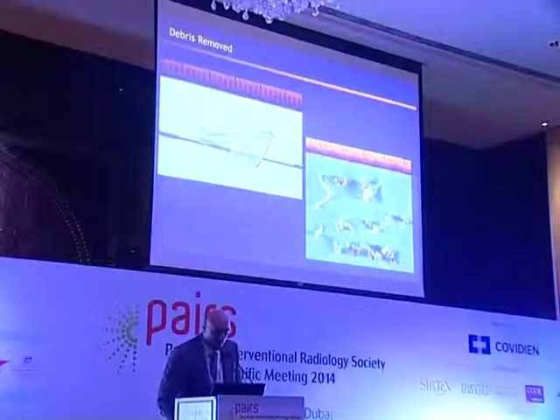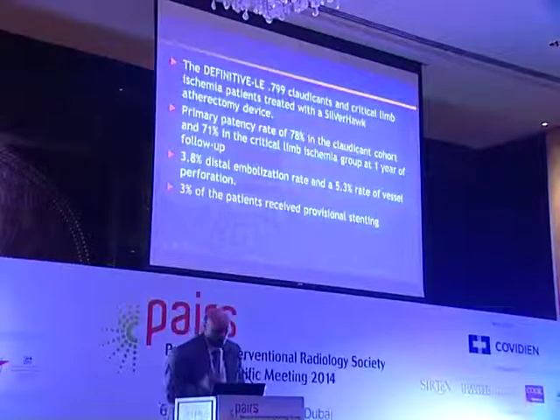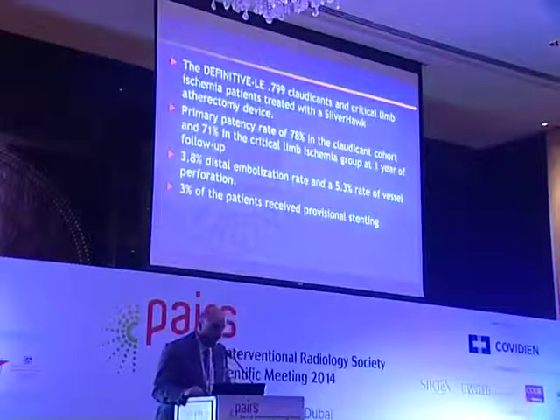These are the debris that they removed, and you just heard Dr. Schmidt talk about that. You can analyze these and look at exactly what's going on. So basically, this is what you remove, and we always recommend using an atherectomy device with a distal protection device.